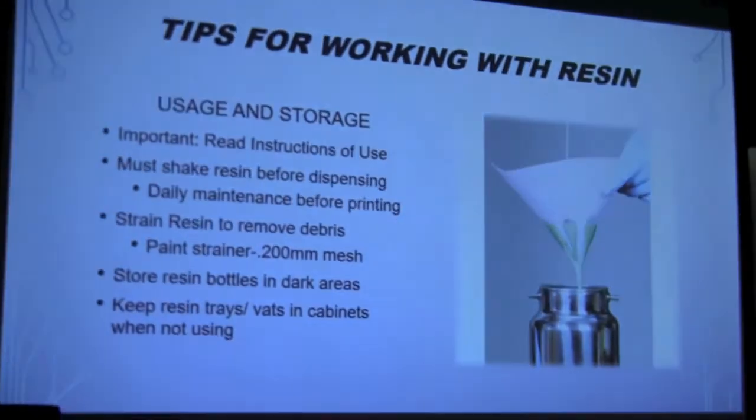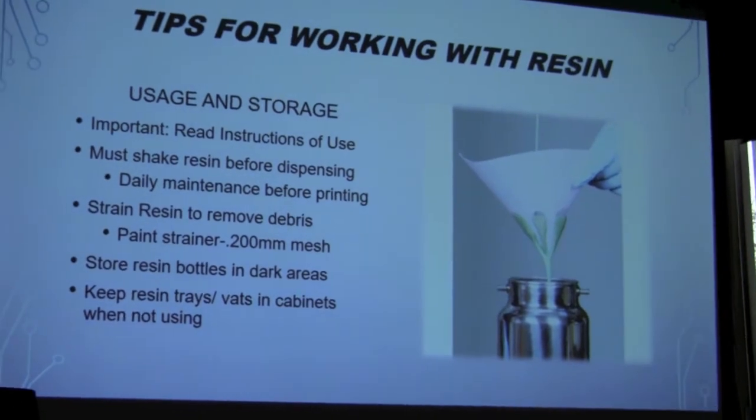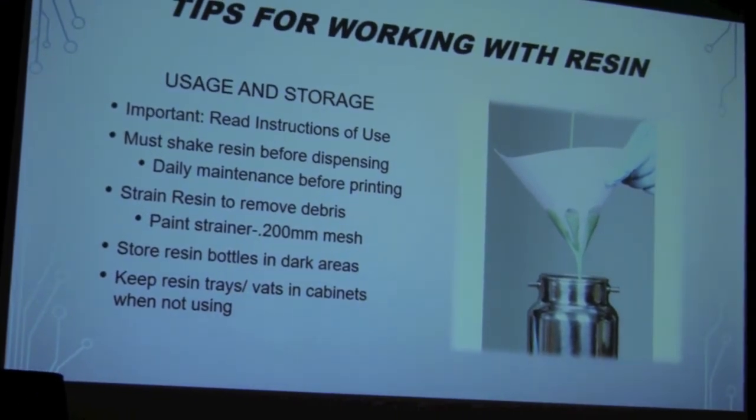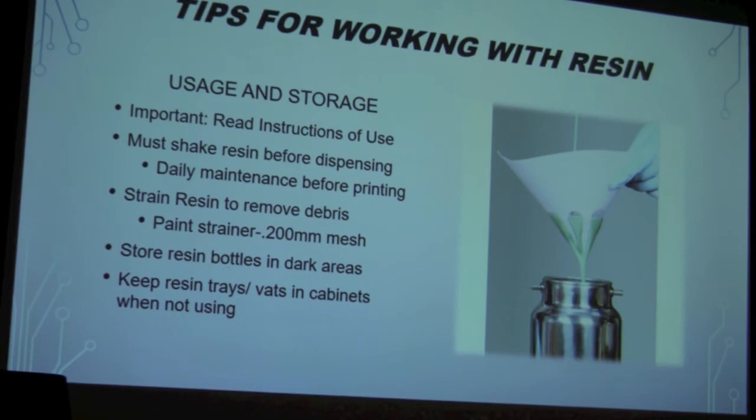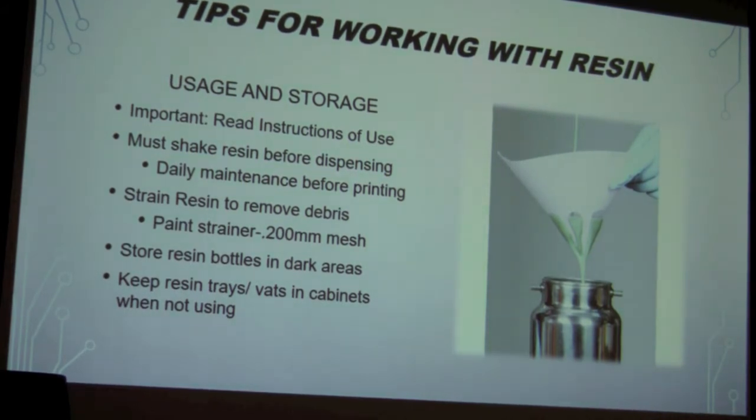So tips for working with the resin. Usage and storage: the number one most important thing is to read the instructions of use for any resin that you have. Some resins require you to shake it up for 5 minutes. Some resins require you to shake the bottle for 3 hours. With Nexdent resin, you actually have to oscillate their resin bottles for 2 to 3 hours to have the resin mixed back together into a homogeneous mixture.